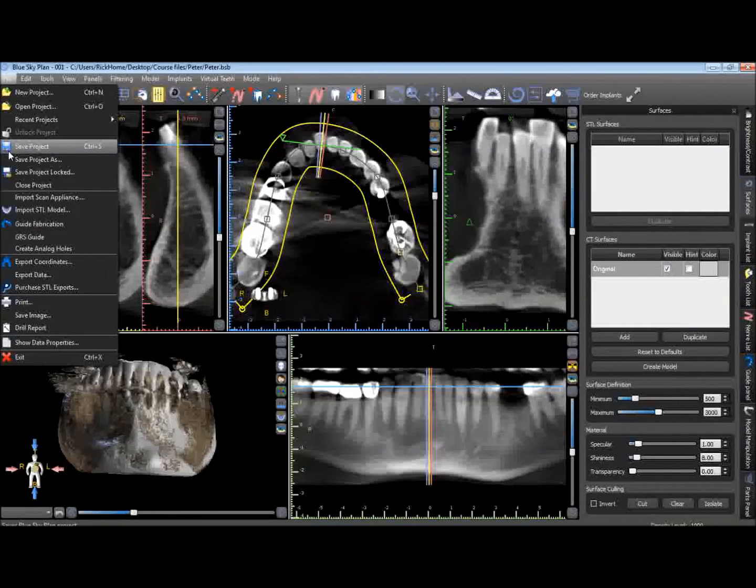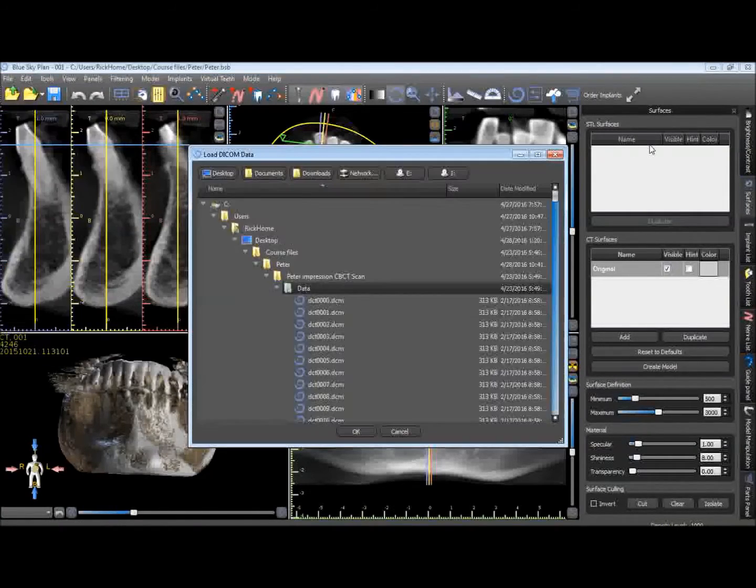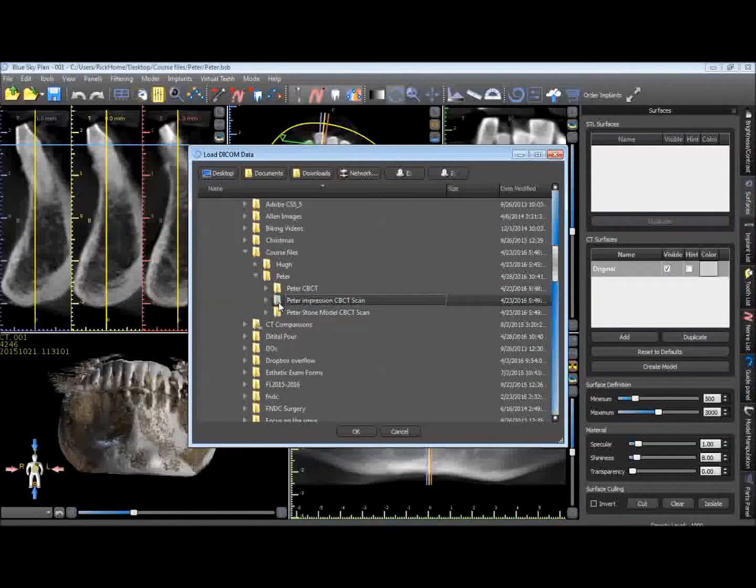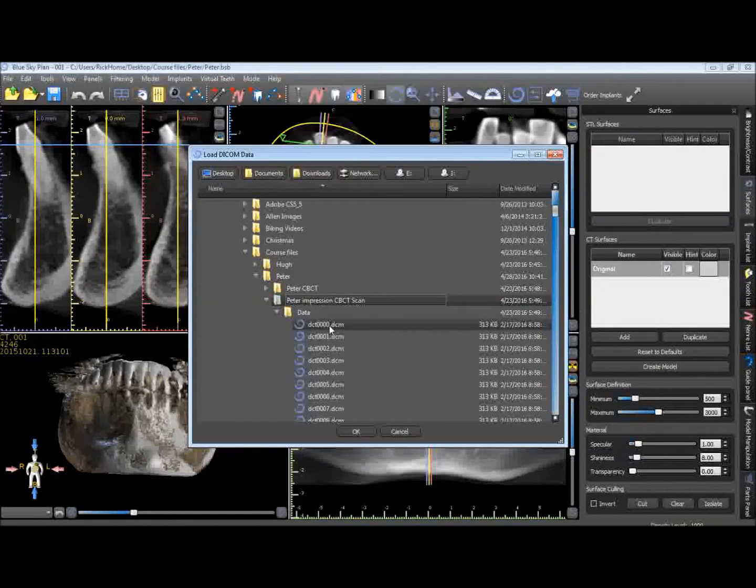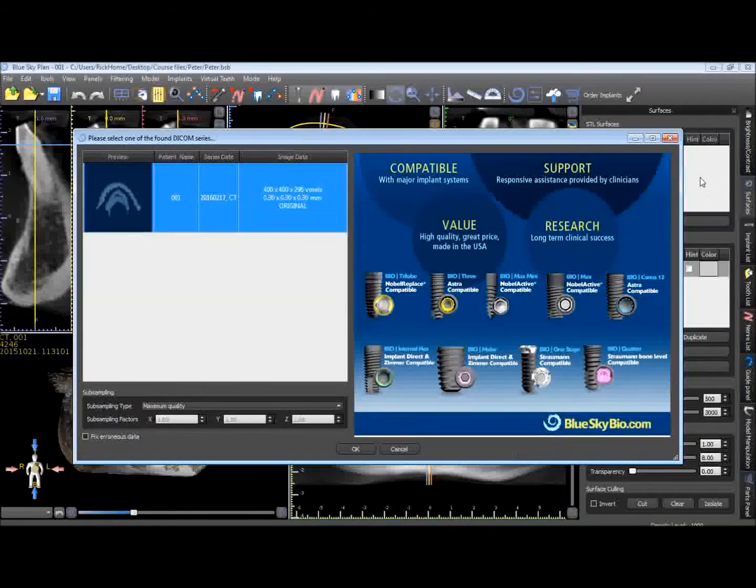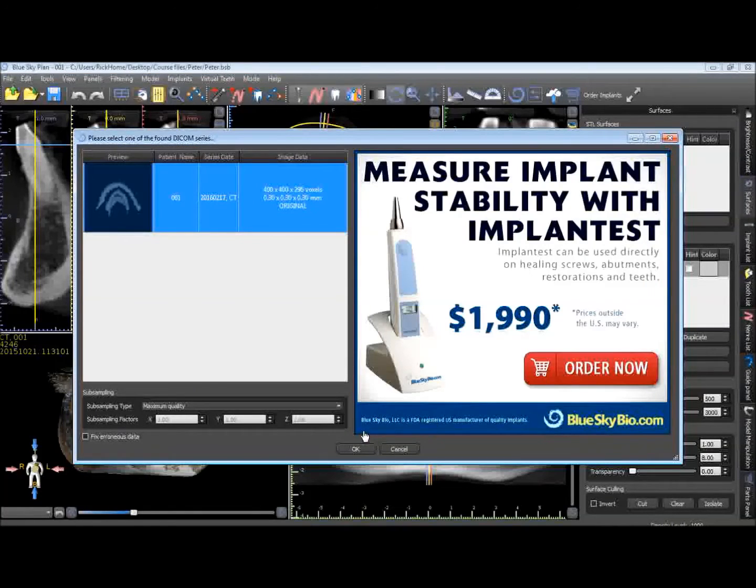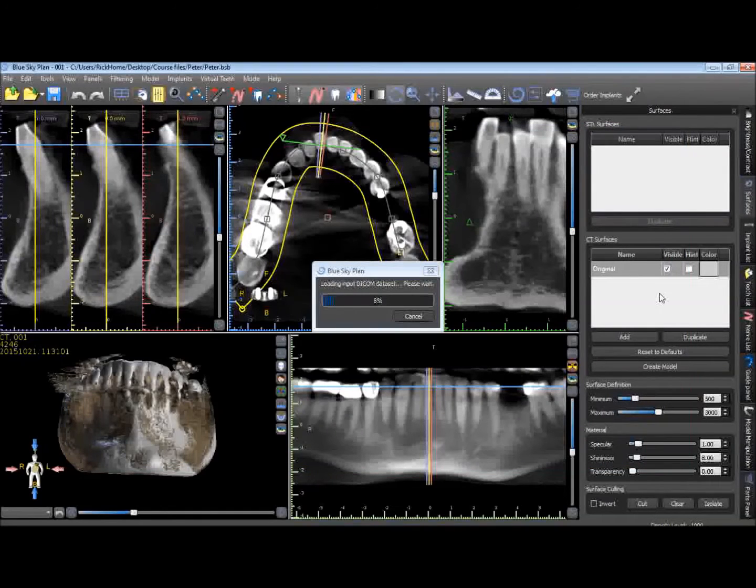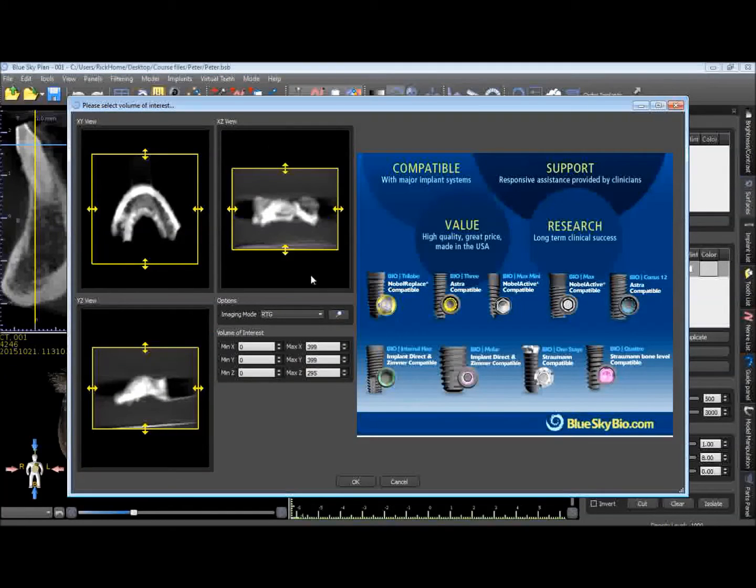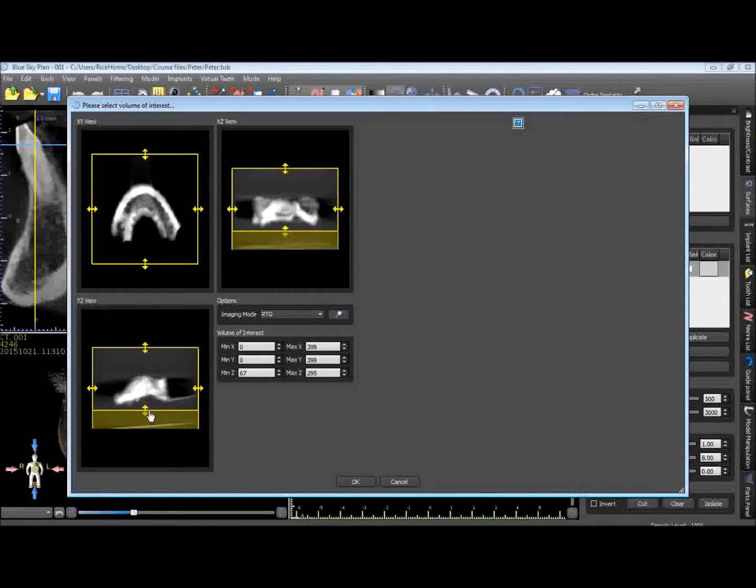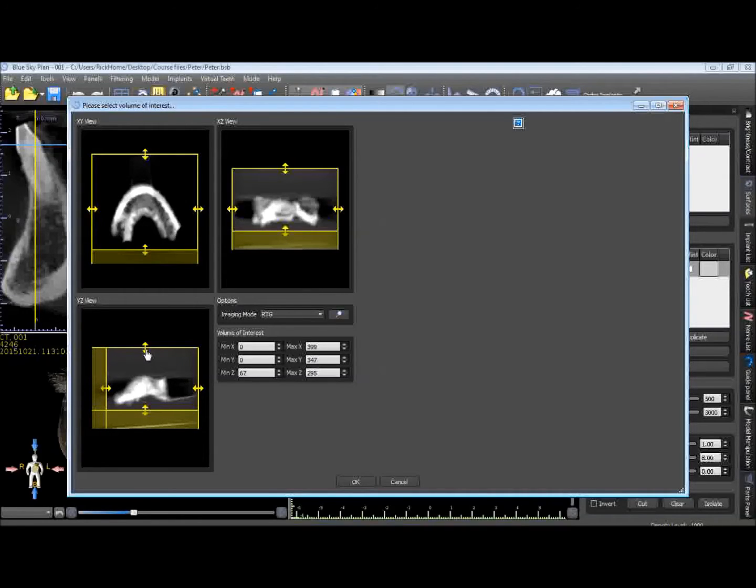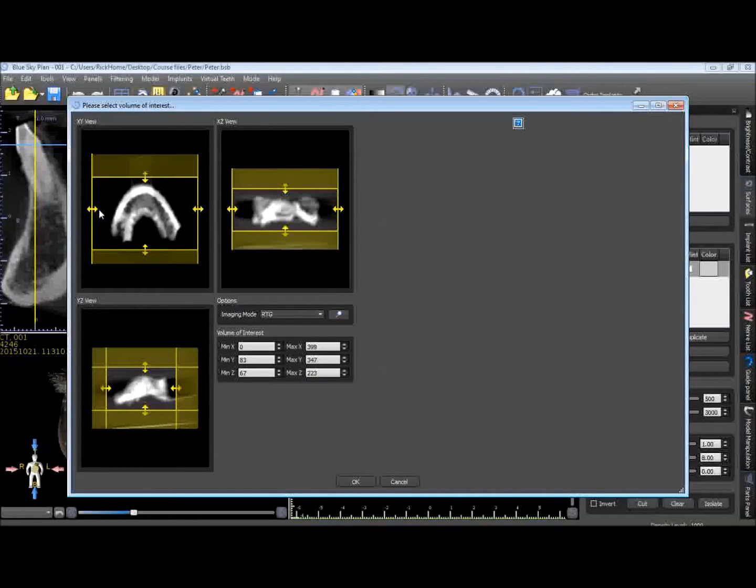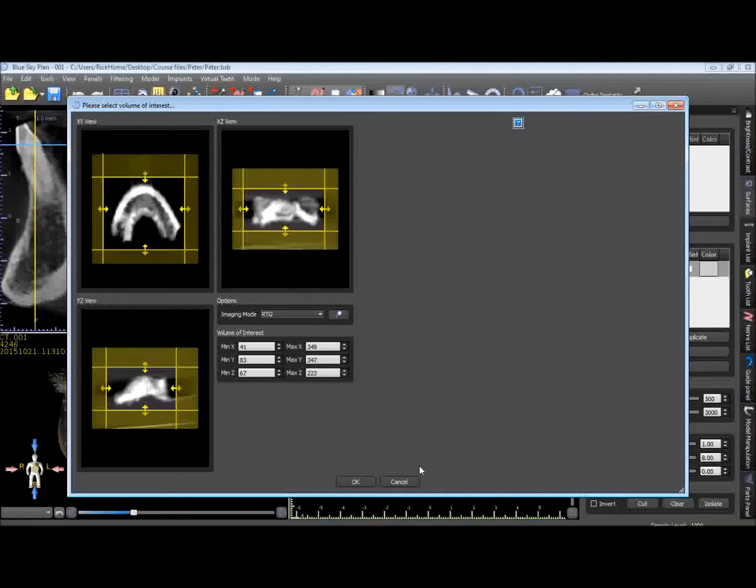We'll then go ahead and import the VPS CBCT scan as a scan appliance. This is what it looks like here. We'll go ahead and hit OK. And we want to remove any areas that we're not interested in. You can see here is the impression scan. We'll go ahead and take out any areas that we're not really that interested in, just reduce our region of interest. We'll hit OK.